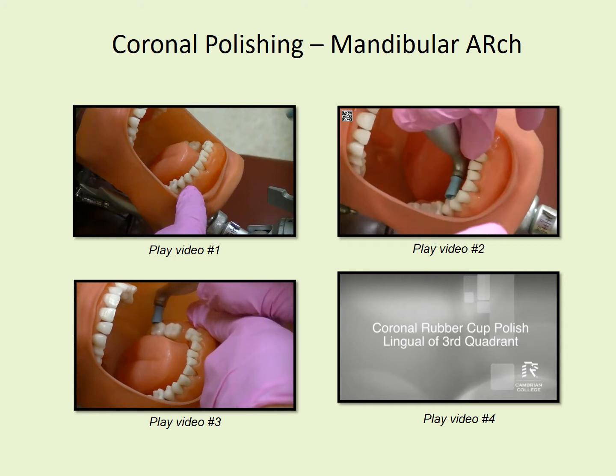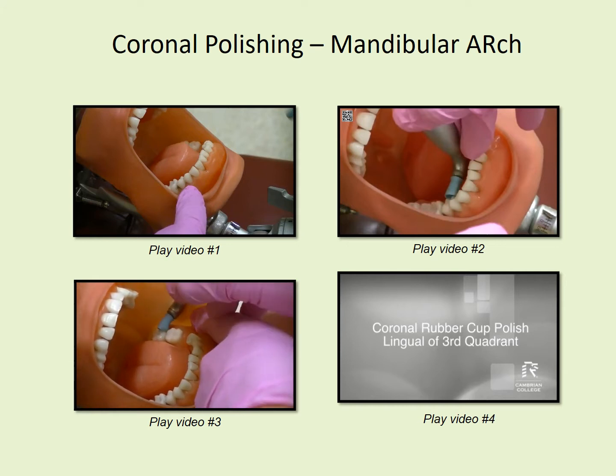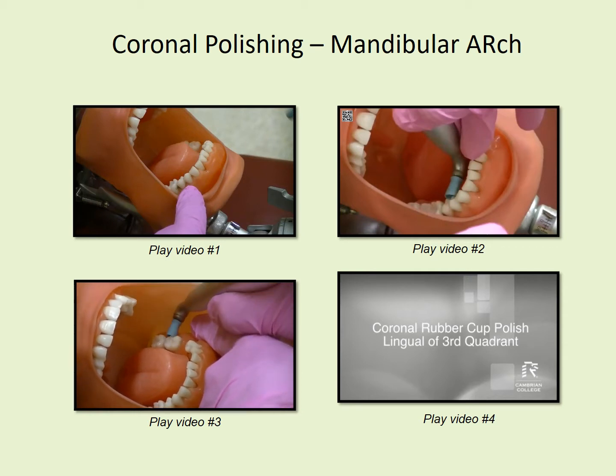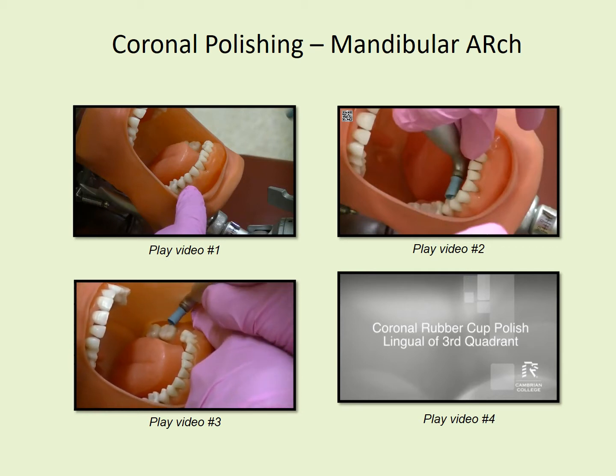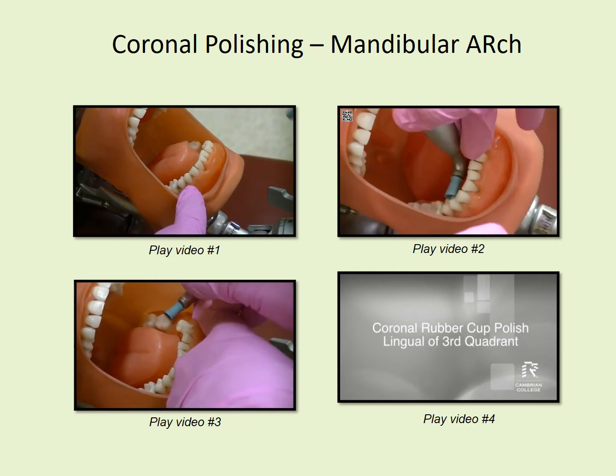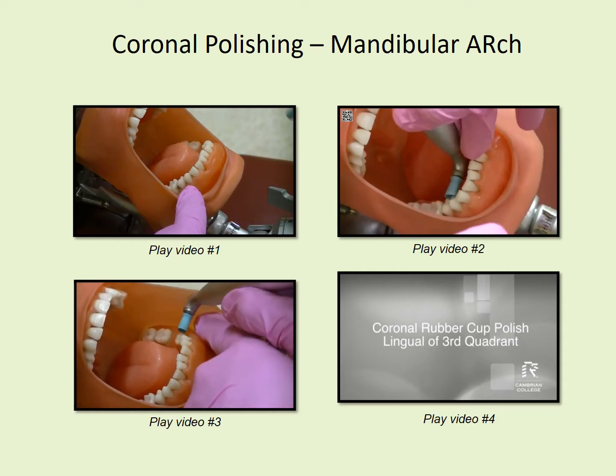Gingival half, pat, pull if needed, and work your way forward anteriorly to the premolar area.